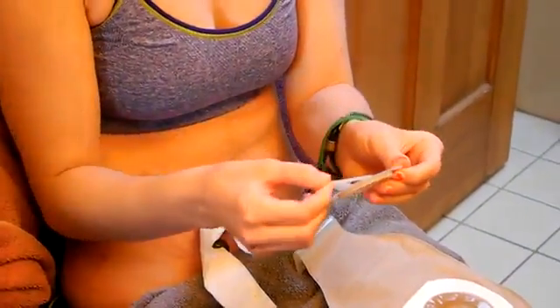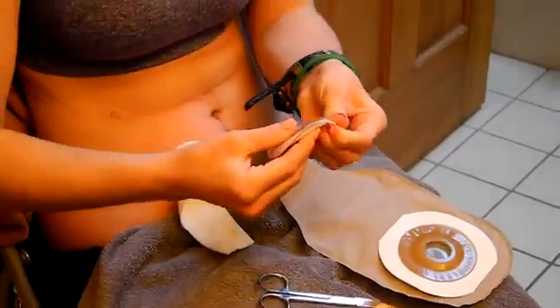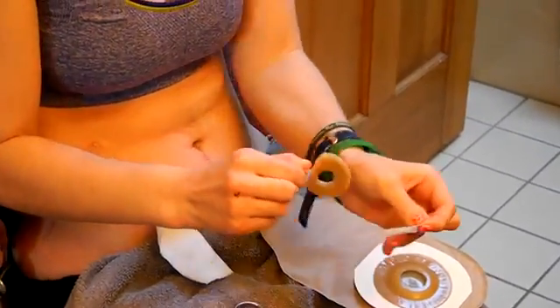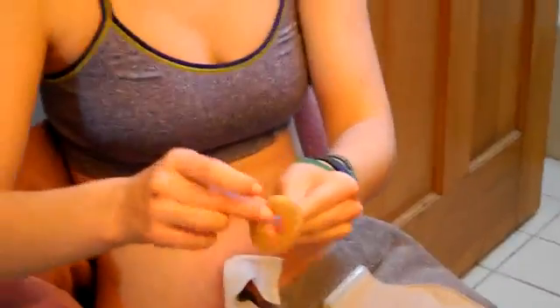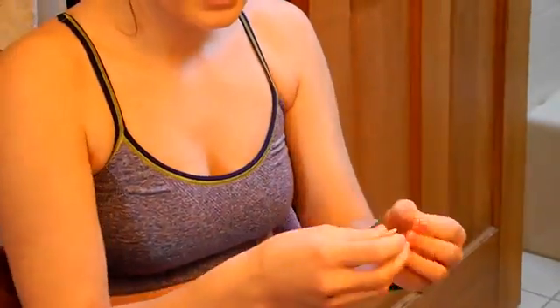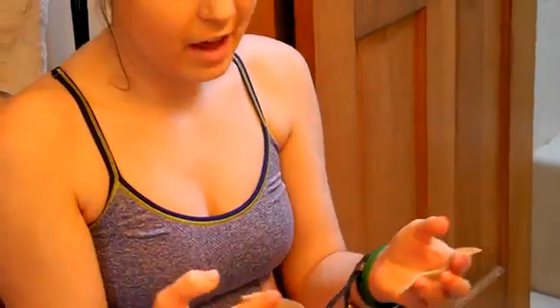Now you can use stoma paste, but I actually use the stoma rings, which are really nice. I absolutely love them. So you just take that out. And actually, this is too big for my stoma, so what I was told to do is break it in half. This is just like the paste, except it doesn't have alcohol in it, which actually is really nice because then if your skin is a little bit irritated, it doesn't sting because there's no alcohol in it.